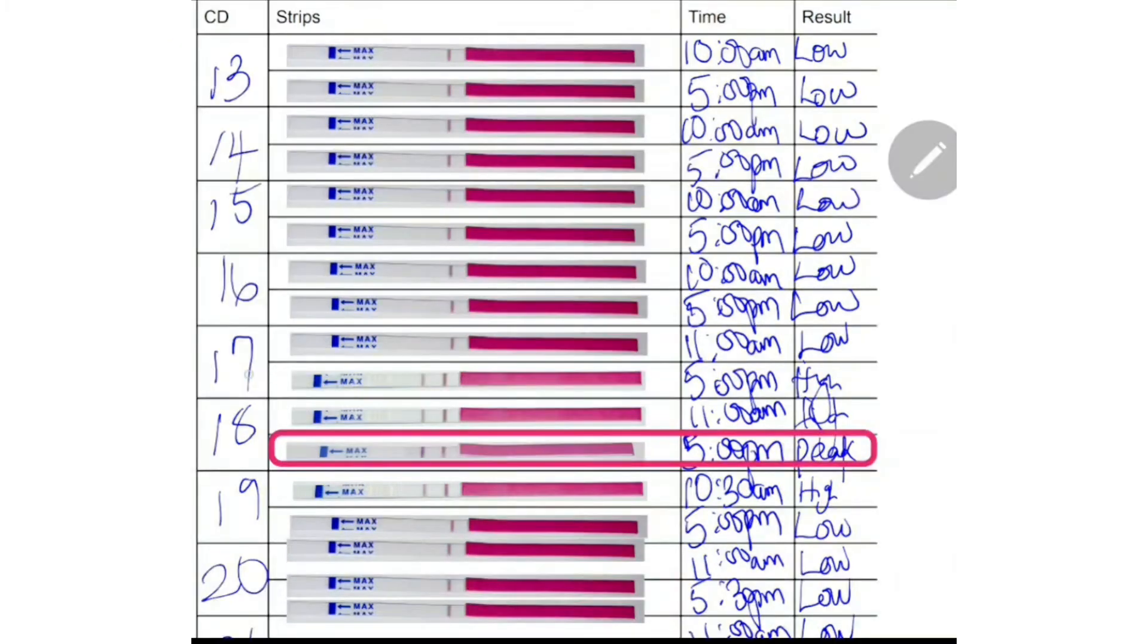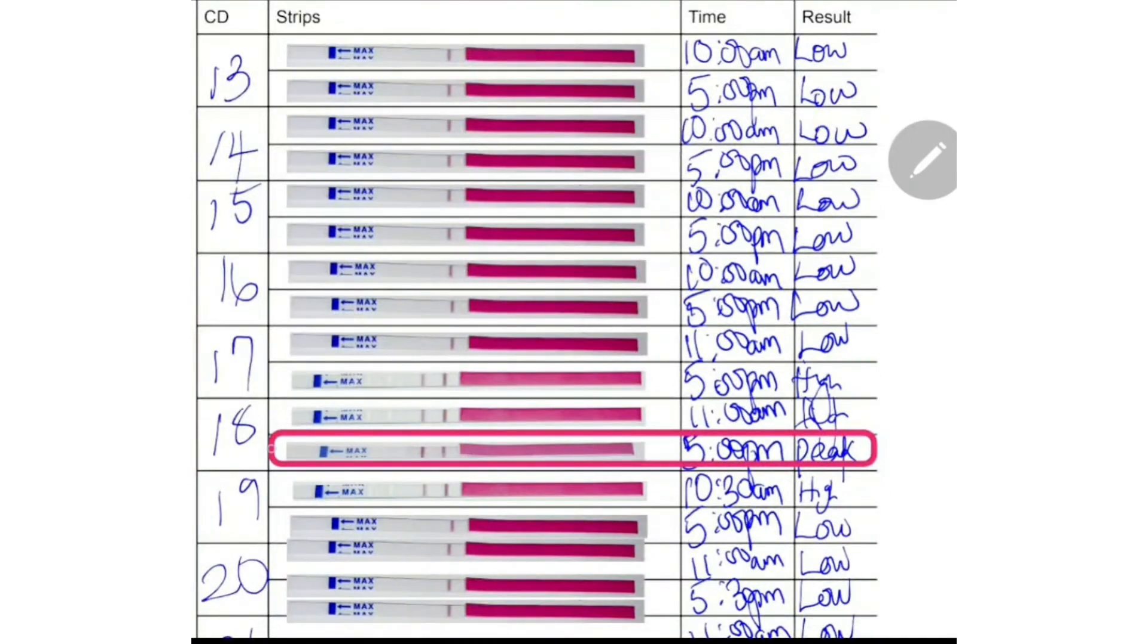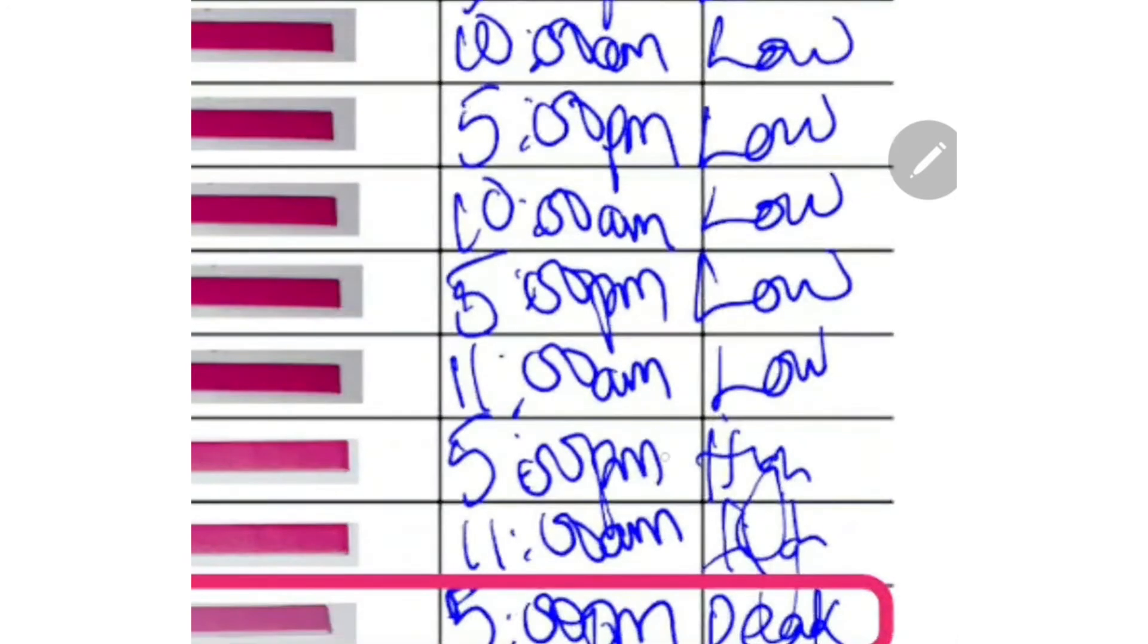On the 17th evening and 18th morning, she recorded high levels of the LH hormone. Because when you look at the strips, you see that the test line is beginning to show. But it's a bit faint, not as dark as the control line.